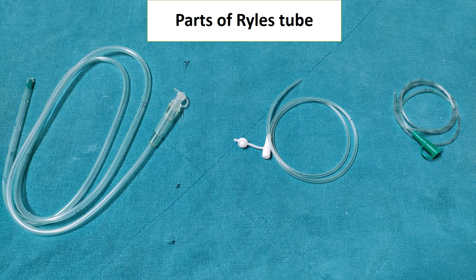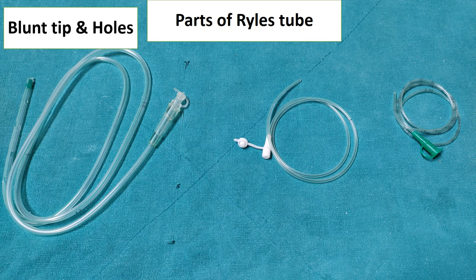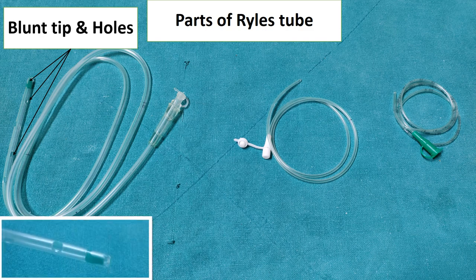There are three parts of Ryle's tube: proximal end, distal end, and the central part. At the distal end there is a blunt tip and holes near to the tip. In this picture you can see the tip of the Ryle's tube, which is blunt and also has a radio-opaque marker. Near to this there are various holes.